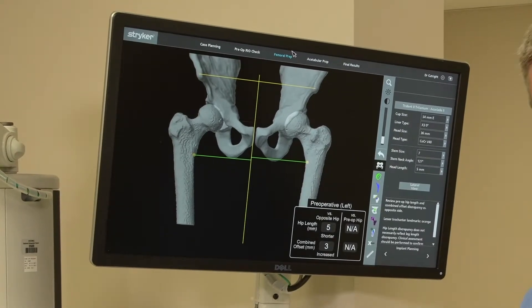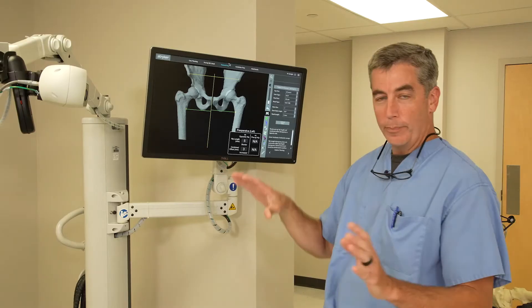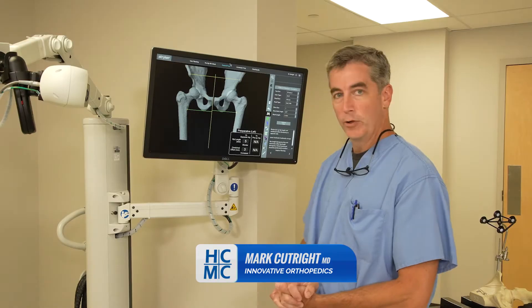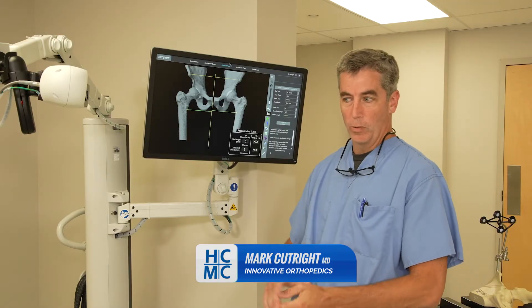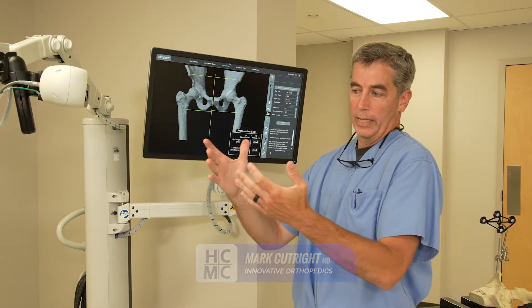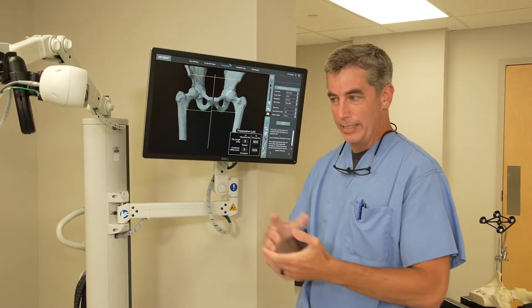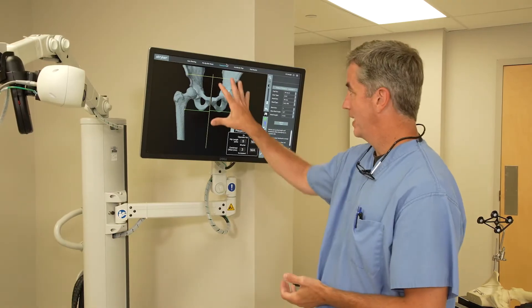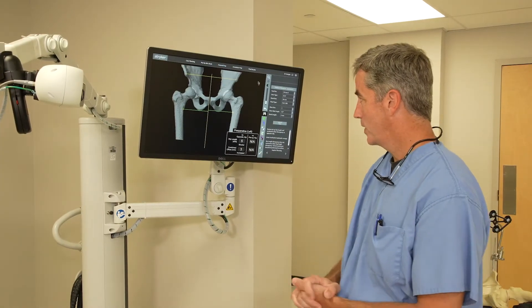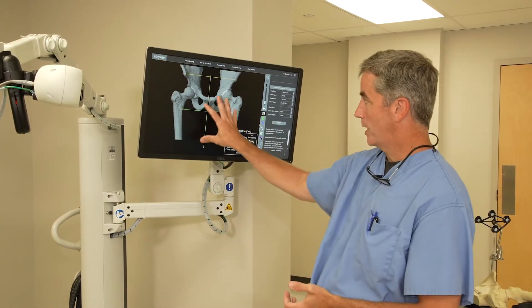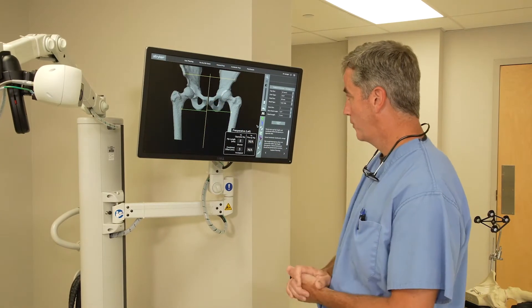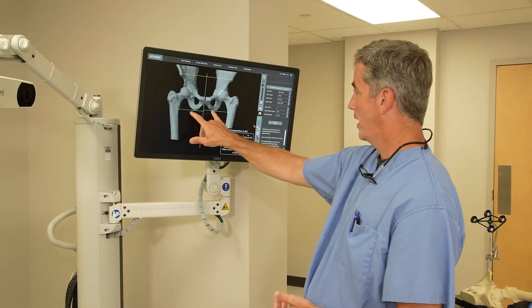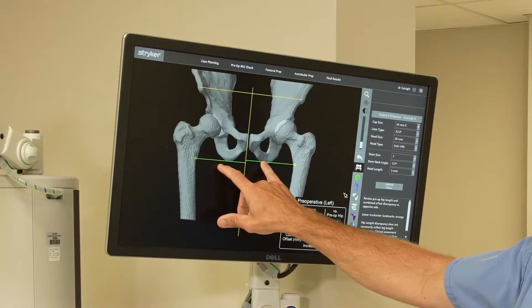Now we're going to look at the hip procedure a little bit. There's a lot of planning we can do on the computer with the hip. We get a CT scan — it goes into the computer. This is the patient's CT scan, kind of like looking at an x-ray view. The main thing we use this for is looking at leg length discrepancy.